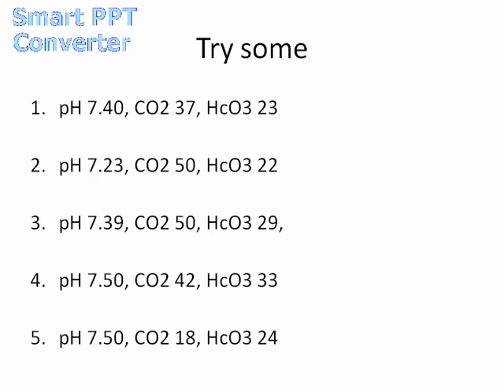We have a respiratory problem. Compensated or uncompensated? We go back and look at that pH again, and it's 7.5, not in our range, so it is uncompensated respiratory alkalosis. So if you just keep practicing these, you use it or you lose it. I have to refresh myself with these all the time, but once I get going on them, it's automatic. You can do it in your head by just looking at the numbers.